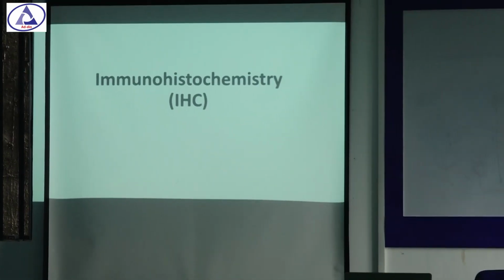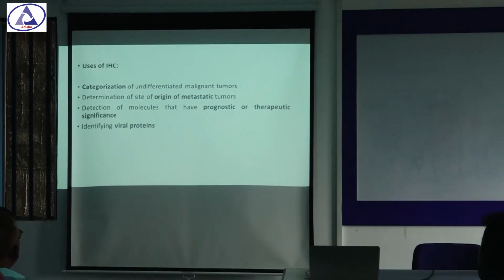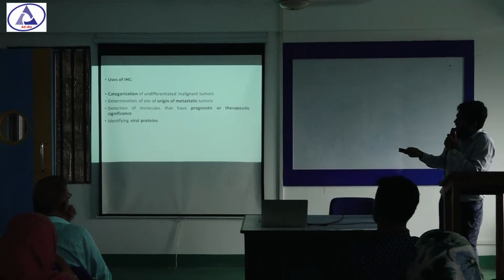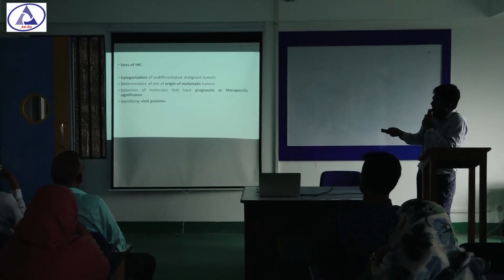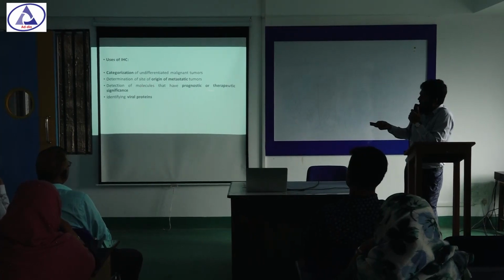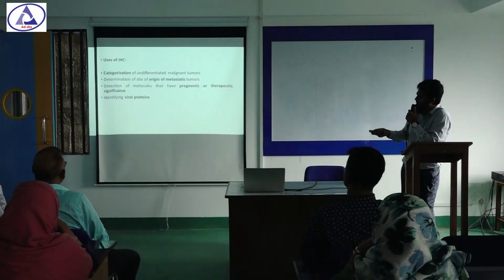Next is immunohistochemistry. The role of immunohistochemistry is categorization of undifferentiated malignant tumors and the determination of the site of origin of a metastatic tumor, and also in therapeutic and prognostic significance.